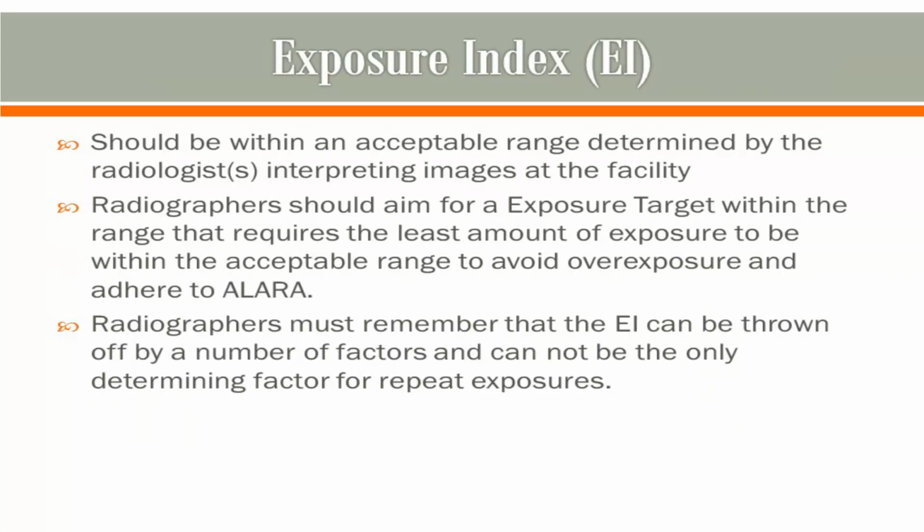The EI is used in computed radiography, or CR, systems. The EI should be within an acceptable range determined by the radiologists interpreting images at that facility. They are the ones responsible for the images being of diagnostic quality, and they set the standard. Radiographers should aim for an exposure target within the range that requires the least amount of exposure to be within the acceptable range to avoid overexposure and to adhere to ALARA.